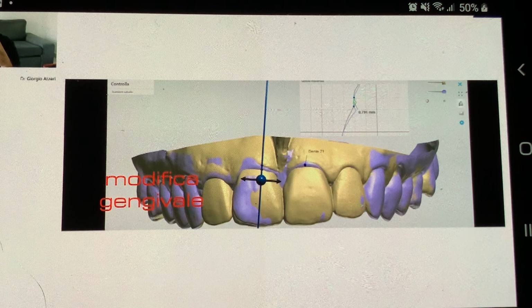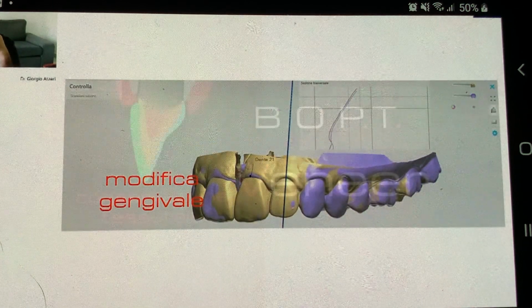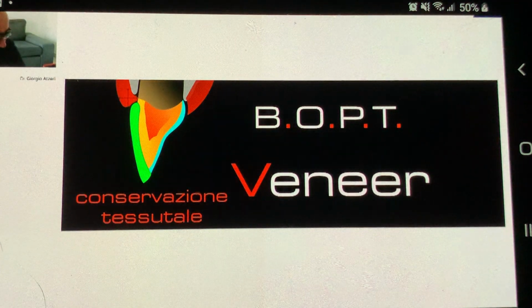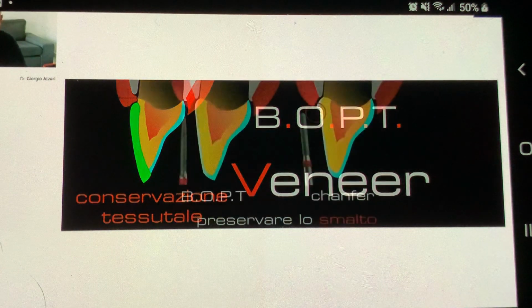We see here that in all the measurement points, there is always a small gingival increment, which is the guarantee of stability of our restorations in the relationships. So the preservation of tissues is our objective through this type of approach.